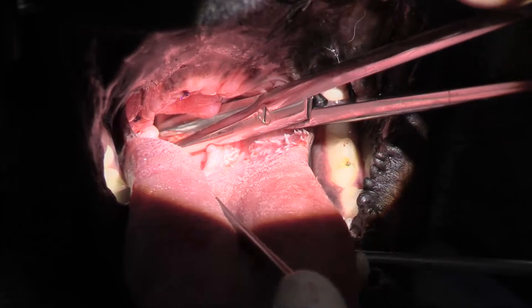That's the other saccule sitting right there, and now I'll go ahead and re-intubate. Just moving the tongue out of the way.